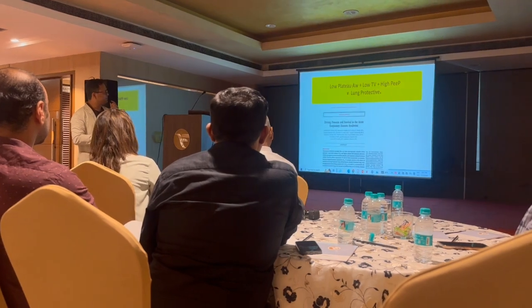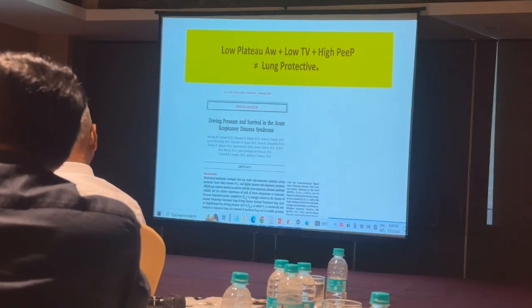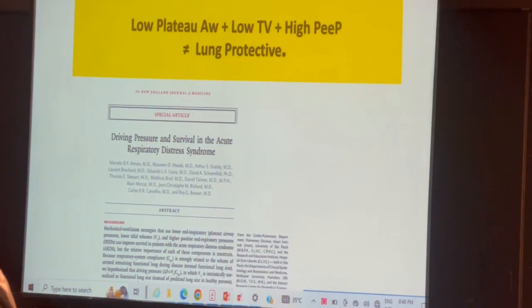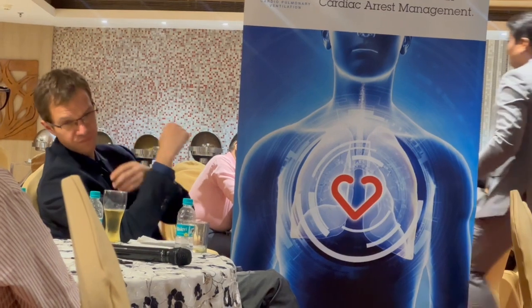Now, driving pressure is important to be assessed in them. I think Ricardo has already spoken about the Amato meta-analysis 2015, which was a benchmark, which said that peak airway pressures and plateau airway pressures are not the most important airway pressures. The most important airway pressure remains the driving pressure. Why? Because plateau airway pressure does get affected by extrathoracic factors, for example obesity, abdominal effusion, pleural effusion. So you need more reliable pressures.